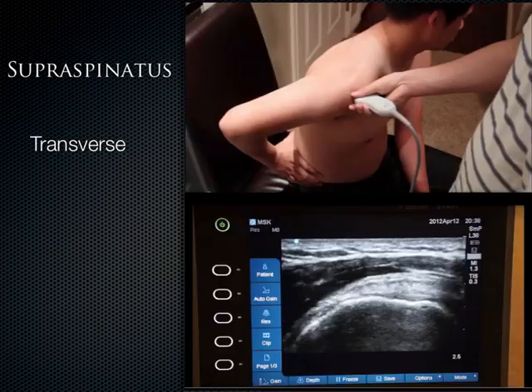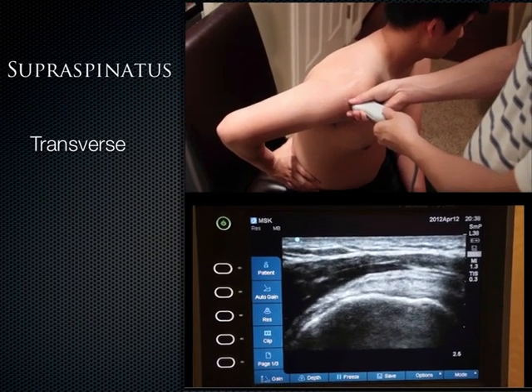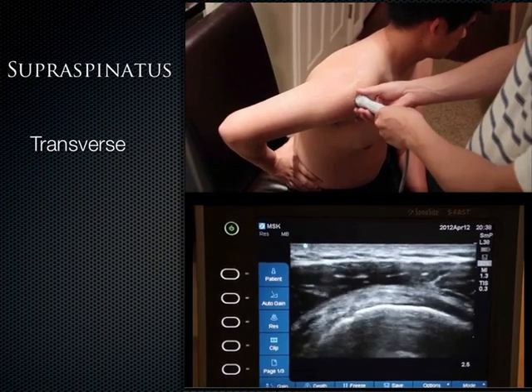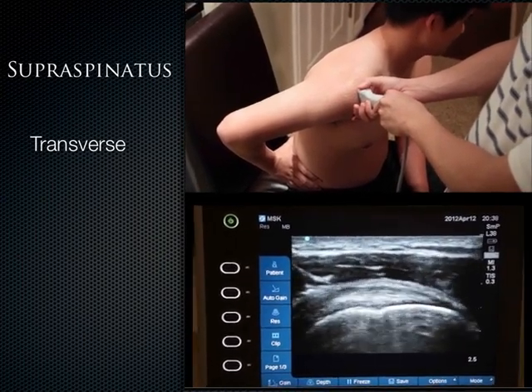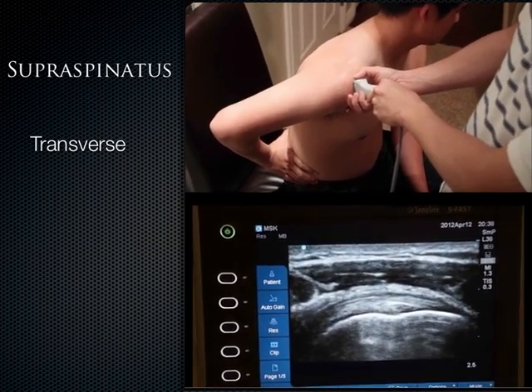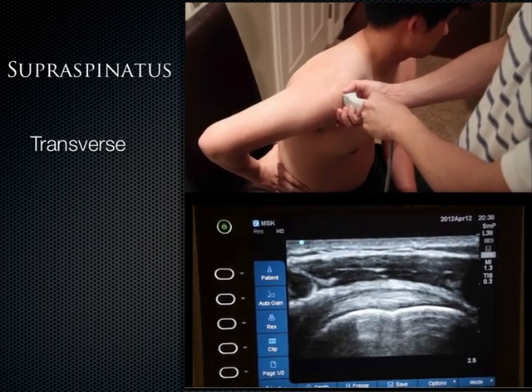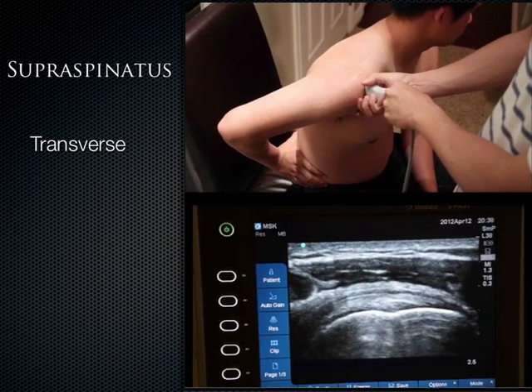Alan's going to describe how to find the transverse. So from the long axis of the supraspinatus, all you have to do is just rotate the probe 90 degrees, so more perpendicular, and point pretty much upwards towards the ceiling. And what you get is the supraspinatus in short axis view. You have the humeral head, you have the articular cartilage in between the supraspinatus and the humeral head, and you have the subacromial bursa that's right on top.